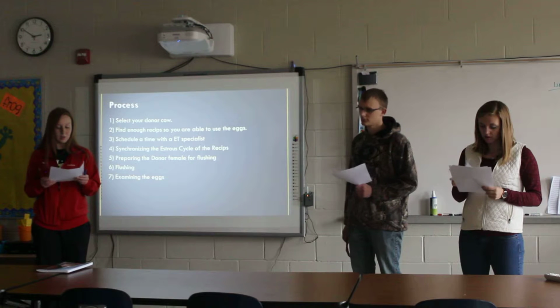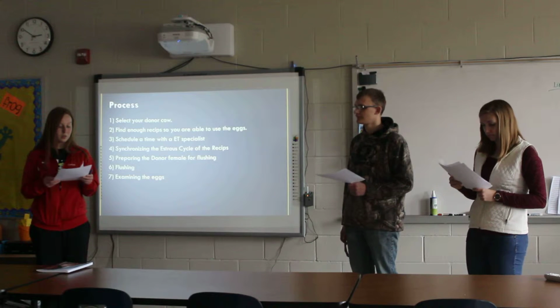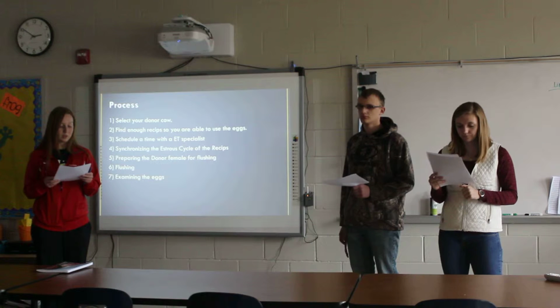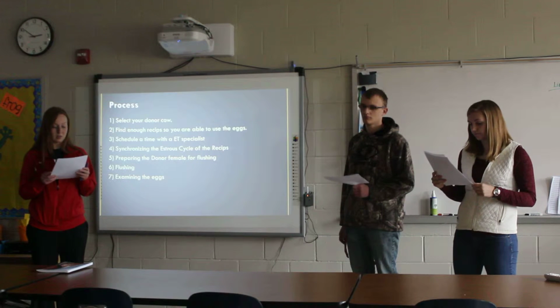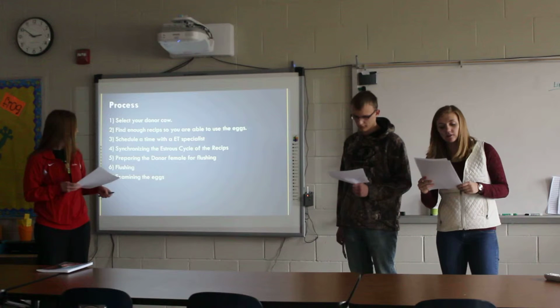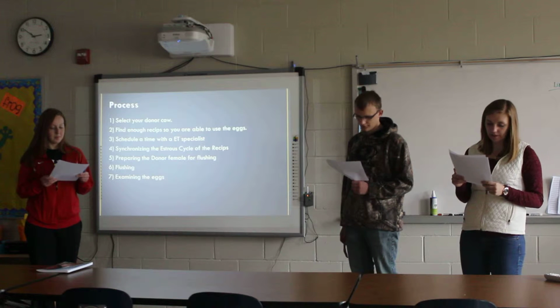Embryos are carried out of the reproductive tract through plastic tubes and collected in a filter with flush media. The pores in the filter are smaller than the embryo, so excess fluid drains out of the filter without losing the embryos. After this process, the uterus is injected with penicillin to kill any missed embryos or infections within that tract. In the lab, embryos are separated from the flush media and examined under a microscope to determine their quality and stage of development.